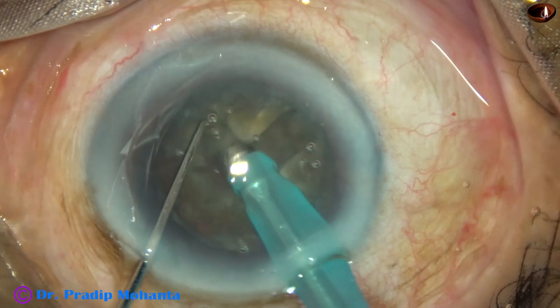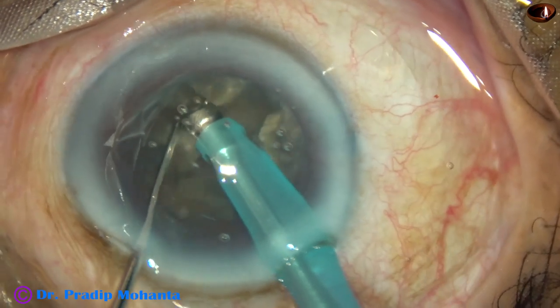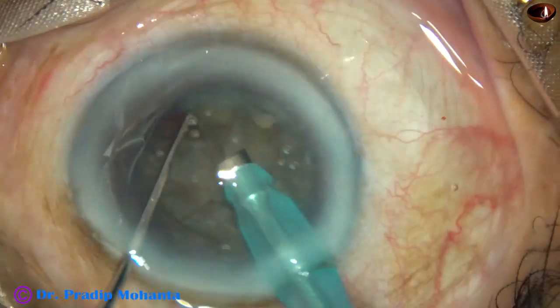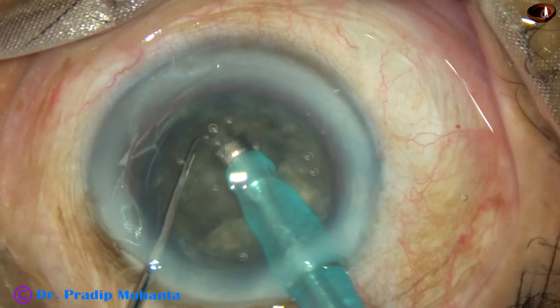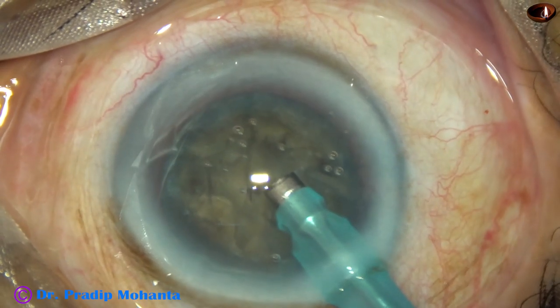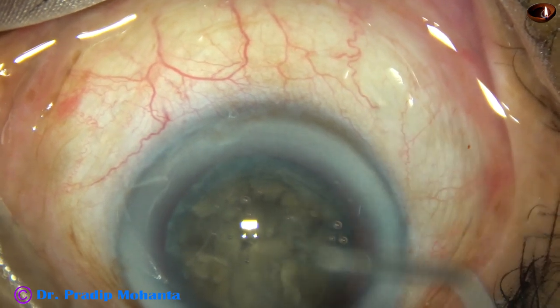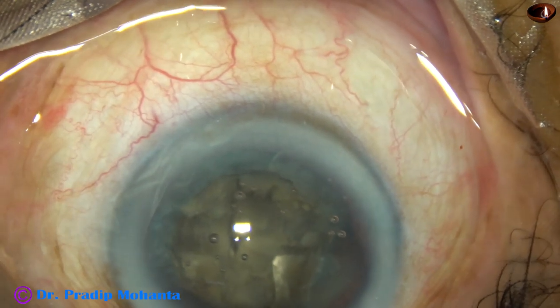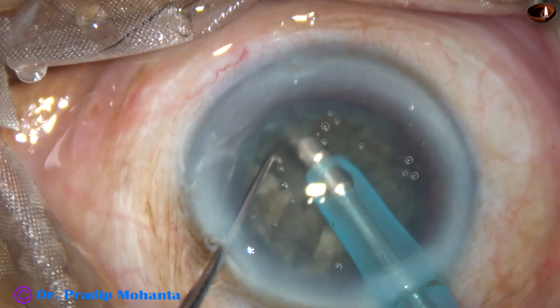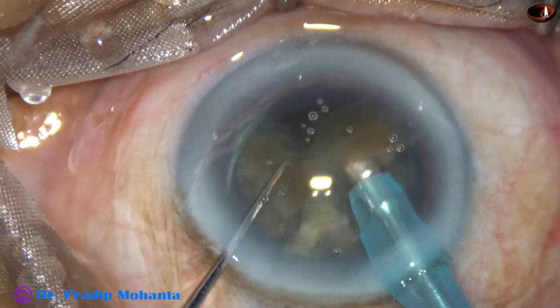The trenches should be deep enough, and then you can start cracking the nucleus into fragments. In this case, the BSS bottle got over at this time, so I had to come out. I inject Visco and wait for another BSS bottle being set up. I go again — this is the final crack — and then I start emulsifying the fragments.